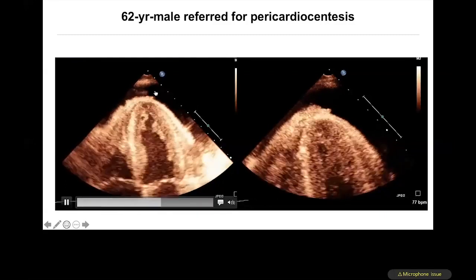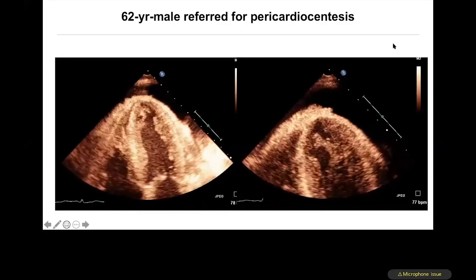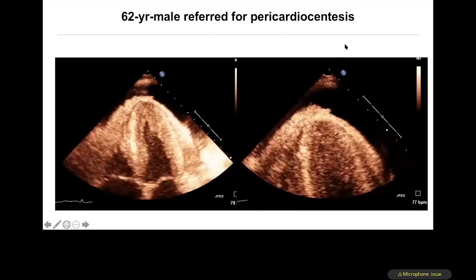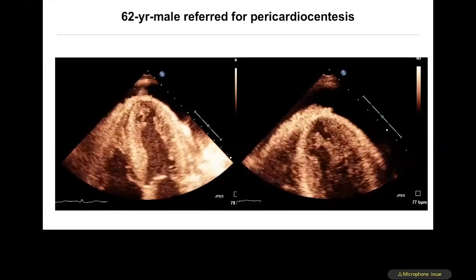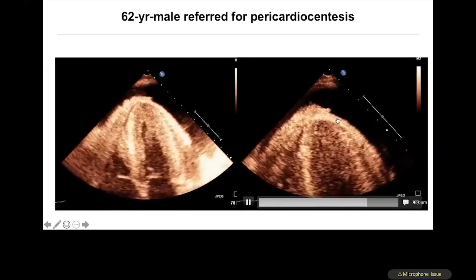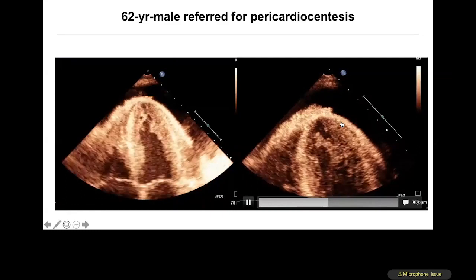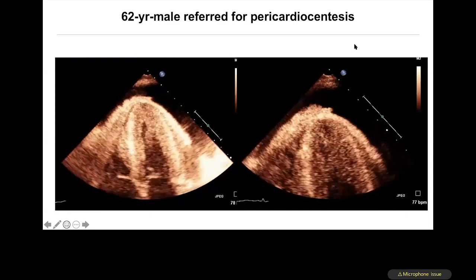You got an effusion on the top, and this is again being brought in for a tapping. Again, the LV function is relatively preserved, but the LV looks slightly thickened. But what you see here is the mistake: this is not a pericardial effusion. This is a pleural effusion, and the pericardial layers, the visceral and the parietal layers, are sliding nicely over each other, so they are not adhered to one another. The underlying myocardium is sliding well. So this patient has something else going on.